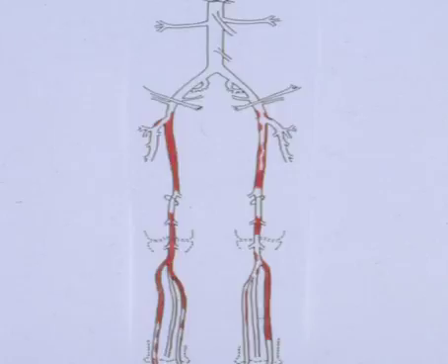When we're all done with our arterial exam, we can make a sketch like this. Sometimes the clinicians like to see exactly what's going on. And again, here we have the aorta and the iliacs and the inguinal ligament, and now the lower extremity arteries. And we can block in where things are open, where things aren't, where there's narrowing. And some folks find this kind of a sketch helpful.